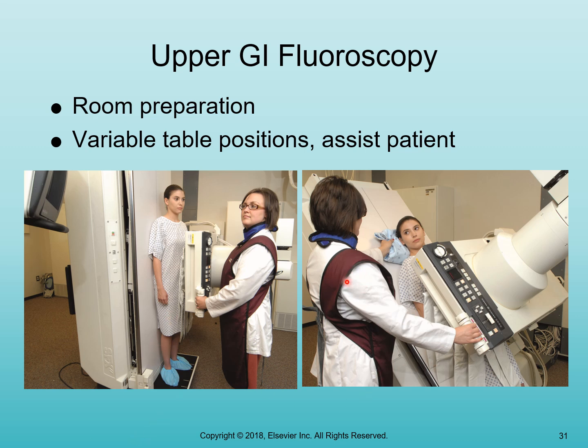At some point, they will lay the table down and then the patient will continue to drink more barium. The entire time, pictures are being made while the patient is upright and moving as the fluoroscopist directs, and while the patient is lying down and moving as the fluoroscopist directs.